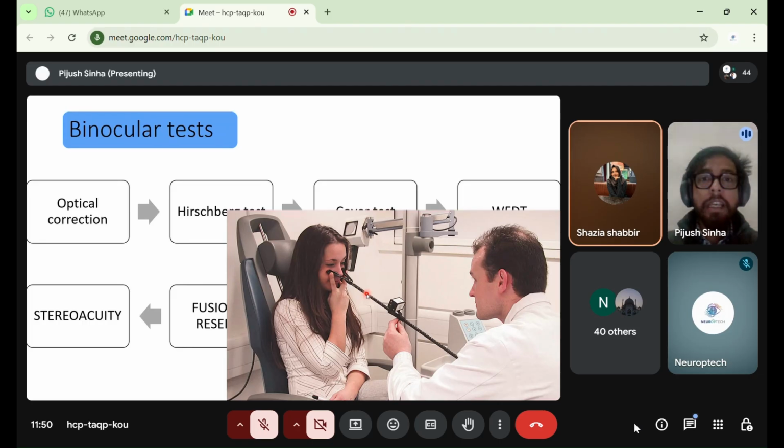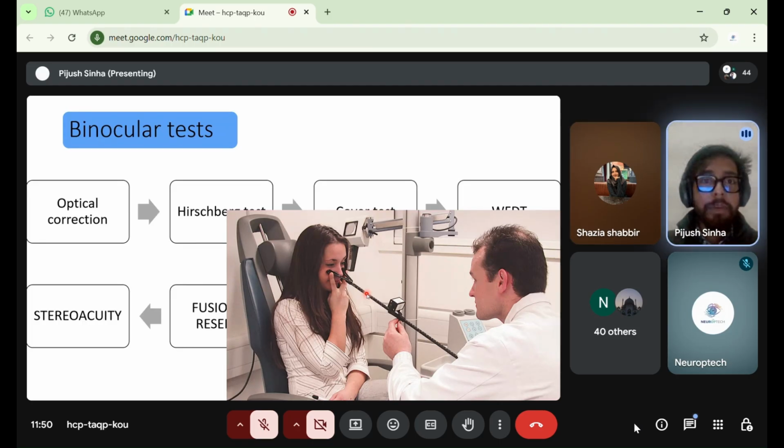Okay, so first of all, in Pentacam, there is not that much role of tear film instability. You are telling about the topography that is based on the Placido imaging technique. So I basically do not prefer topography. I prefer tomography, that is the Pentacam. So here, even if the cornea has severe dryness, we can still go for the Pentacam.